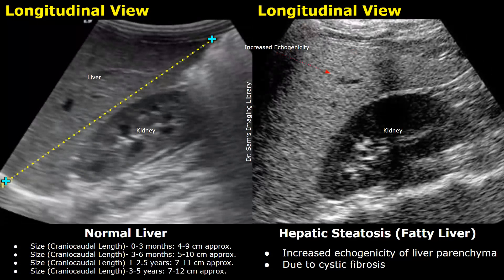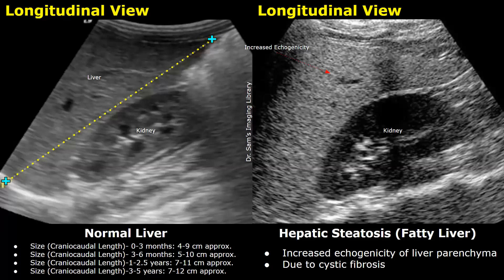The normal craniocaudal liver length ranges from 4 to 9 centimeters in 0 to 3 month infants, 5 to 10 centimeters from 3 to 6 months, 7 to 11 centimeters from 1 to 2.5 years, and 7 to 12 centimeters in children aged 3 to 5 years. These are approximate measurements with some variability between patients.